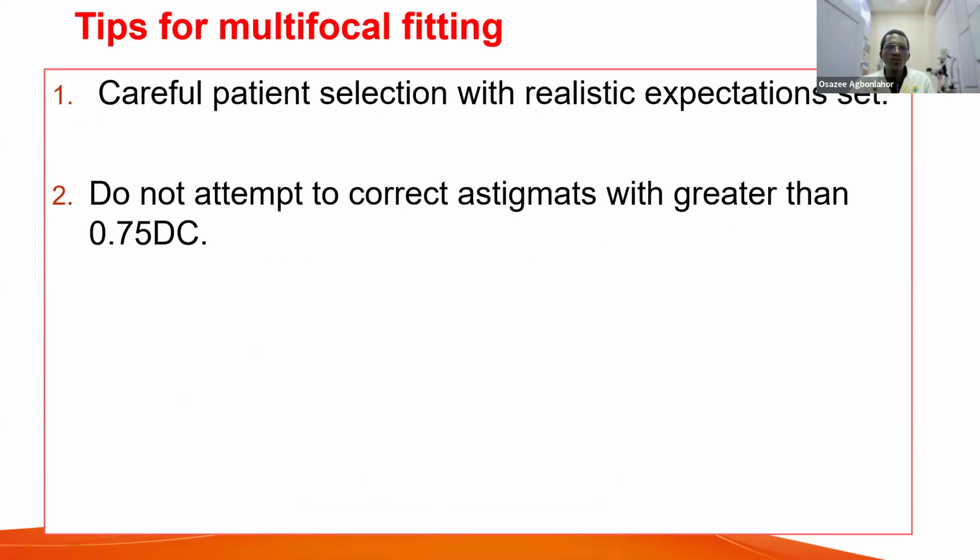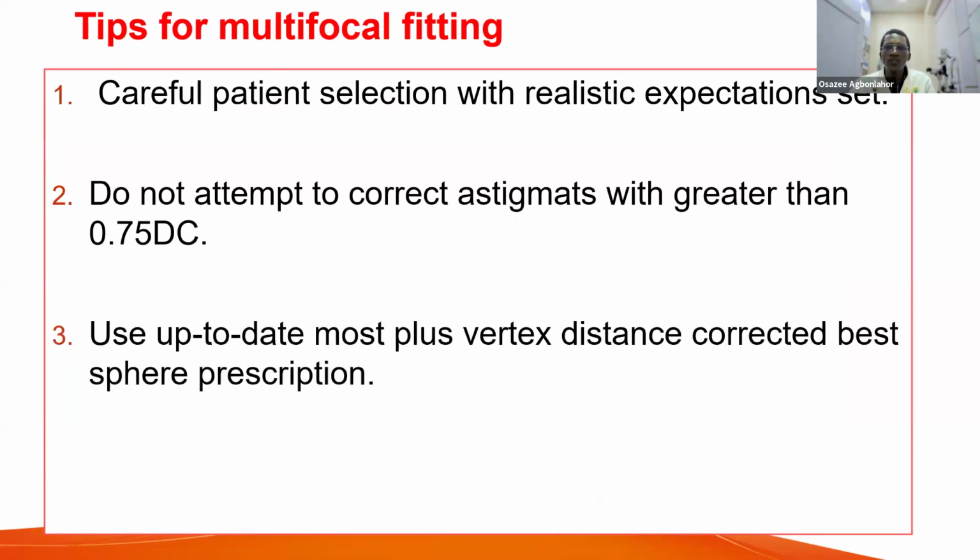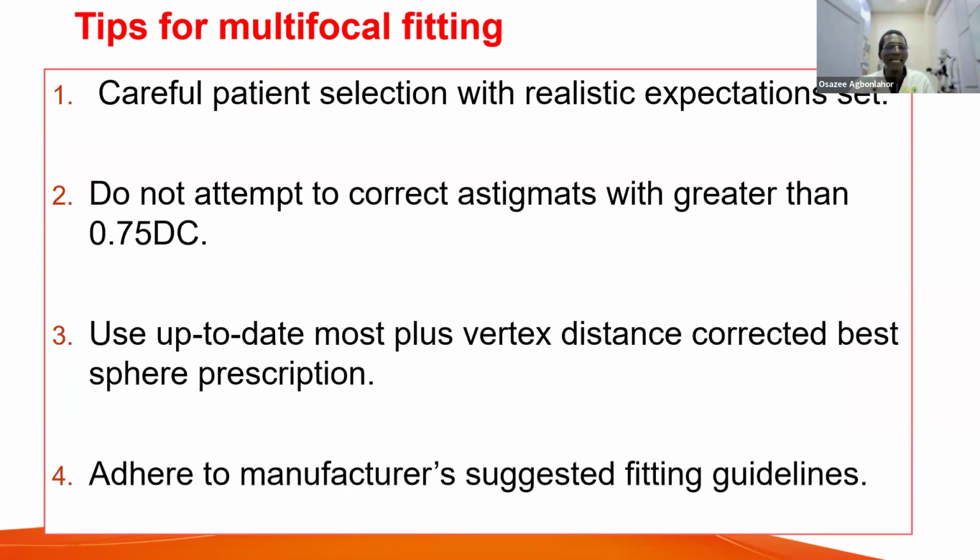Carefully select patients. Some of these things we said before. I just wanted us to not forget it. That's why I had to put it at the tail end of this presentation. So adhere to manufacturer's guidelines.